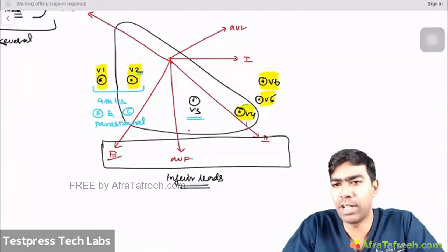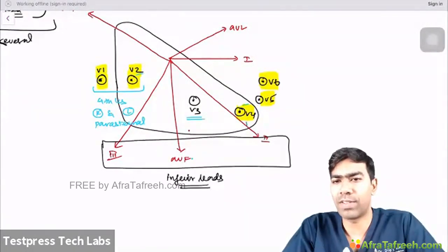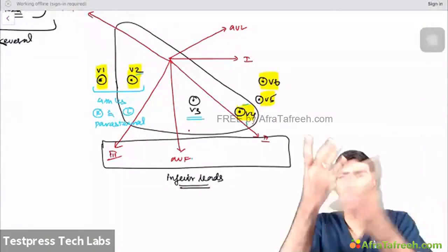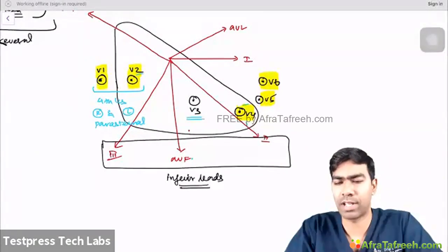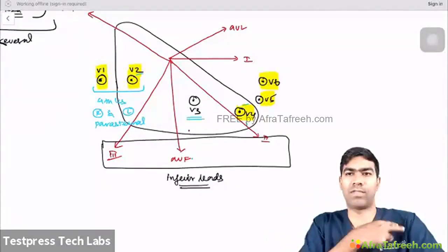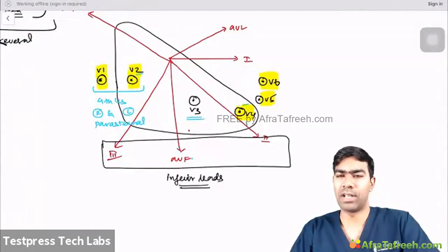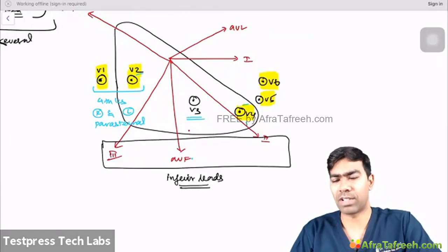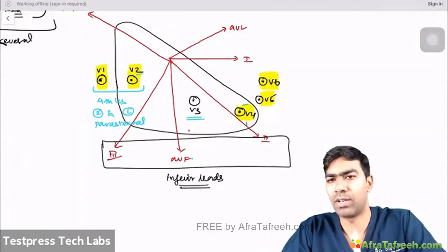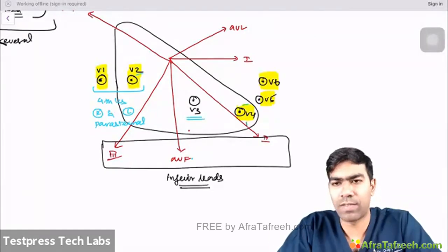We're talking about the limb leads here. So yes, of course, minimum it should be placed at the shoulders at least. For example, you would have seen in the ICU where the strips are running, you cannot really keep big leads and monitor the patient, so the ICU has sticker-type leads. They stick on the right arm, left arm, and the left leg. I mean, they don't go up to the left leg, but keep it in the hip region, probably near the left subcostal region. This will form the Einthoven triangle, and now you're going to get 1, 2, 3, aVL, aVR, aVF. That's fine. So anyways, let us move back to what we are supposed to discuss.